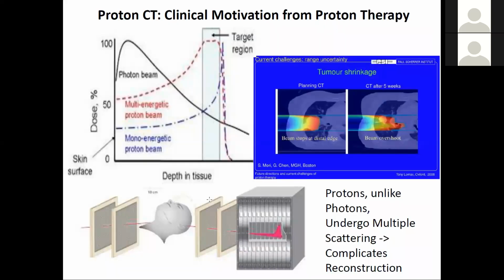Okay, that, please, for heaven's sake, I'm going to have extra time because I've made it to 15 minutes before and I hit the protons. So I'll throw protons at you guys, because we ran into it with the time. This is another form of transmission tomography. I've worked on this some, where this is measuring when you're doing proton therapy.